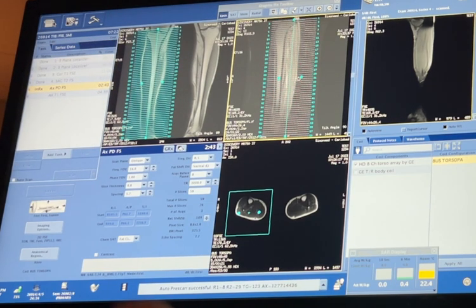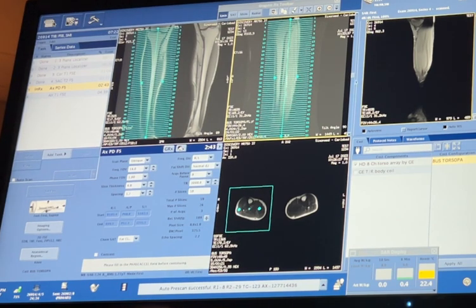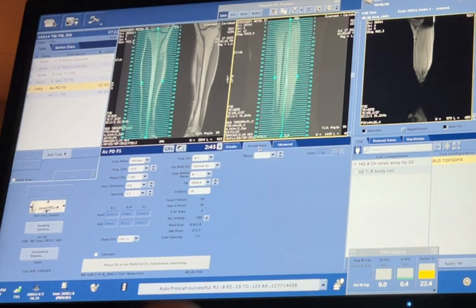Just grab it anywhere, but yeah, there you go. Perfect. Okay. Now you could save and scan. Oh my god, that acceleration factor again. I thought we changed that. Okay, and you could save.